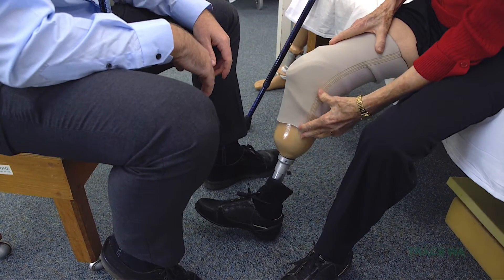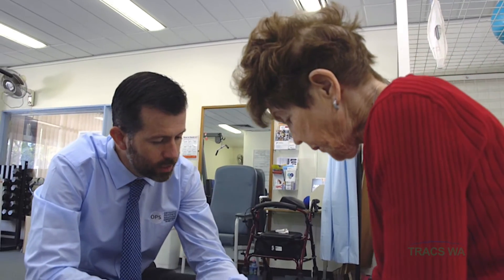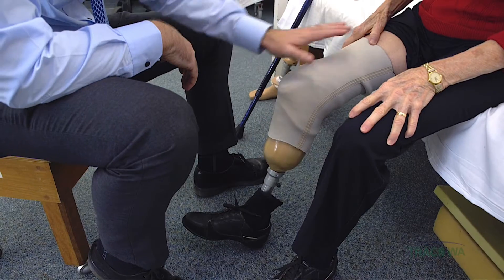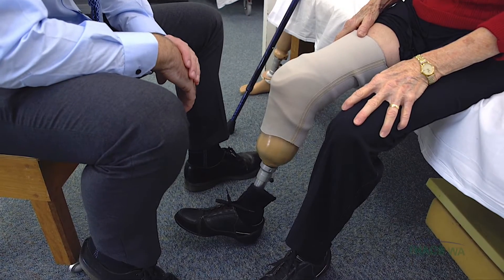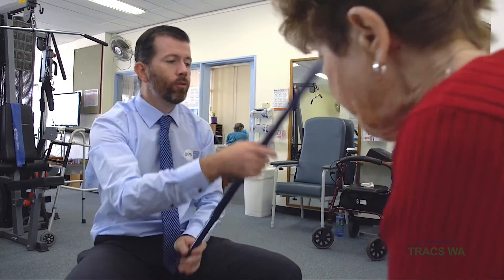So I should have the same amount on each side? What we're looking for is three or four inches of the sleeve onto your skin and three or four inches onto the socket. We've got a little bit more on your skin and a little bit less on the socket, but that's what we're aiming for. I'd like you to stand up for me now.